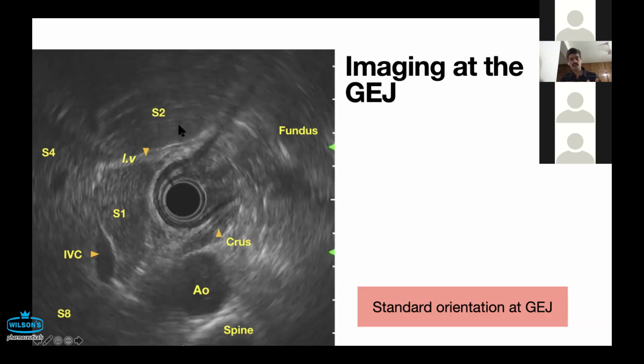But now let us start looking at the liver. This is the fissure for the ligamentum venosum. And this is the caudate lobe, which is again very close to the probe, between the probe and the cava, like the linear EUS scope. So the imaging is the same, only the orientation is perpendicular. The ligamentum venosum separates the caudate lobe from segment 2 and segment 4. And you can see the left hepatic vein, the middle hepatic vein, and segment 8 very clearly. So we see this all the time. Just recognize what we are seeing.